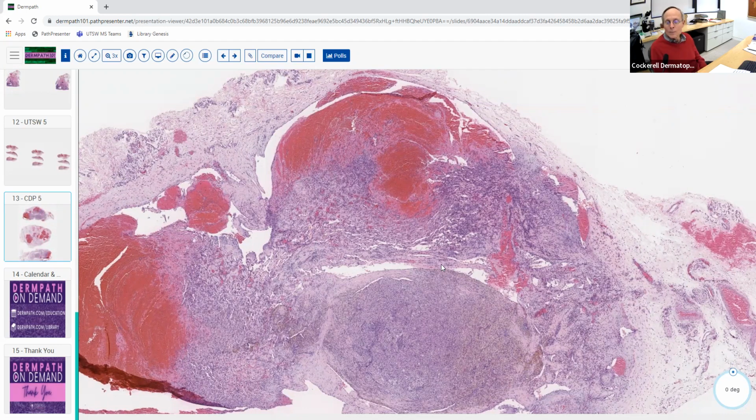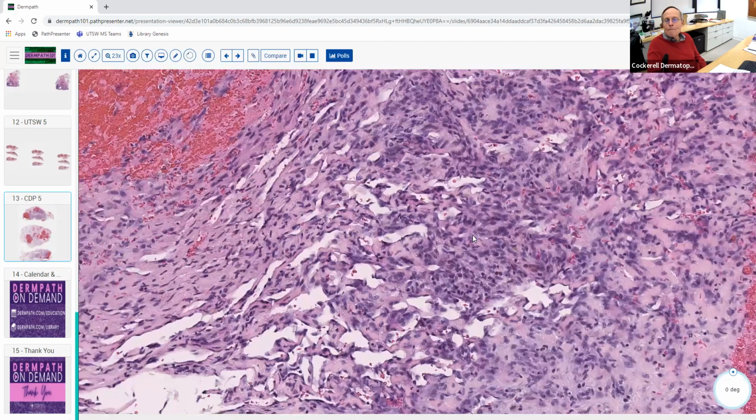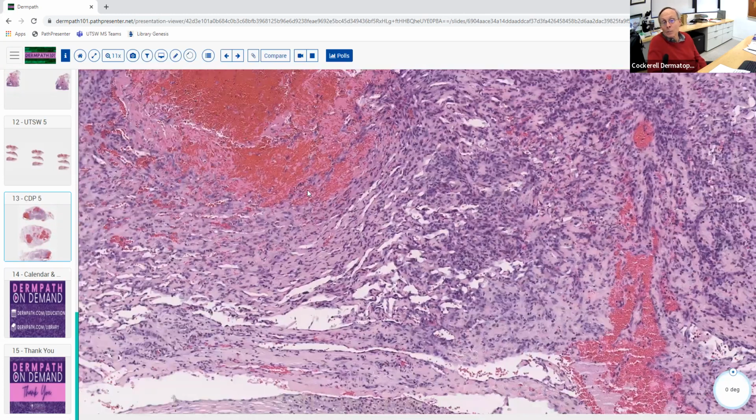And it's sort of in the family of lobular capillary proliferations, which includes this pyogenic granuloma. Bacillary angiomatosis is a lobular capillary proliferation. Bartonellosis, verruga peruana, is also yet another one. So there are entities where you get this sort of lobular capillary proliferation. They all sort of look similar to this. Same sort of end stage reaction, usually due to some kind of stimulus. This one due more to trauma with clotting in the blood vessels, if you will.